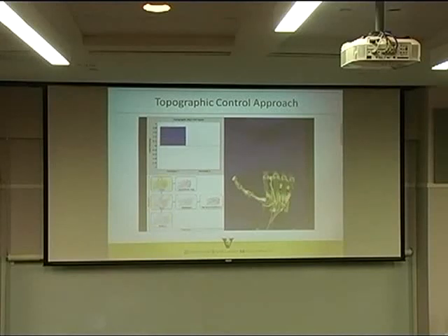You drive up the map here with that 1 signal. You take a right, which is this signal, and you're in that. That's called a lateral or key grasp. Now you go back to platform, and this next time it's going to go up to point, and then you're going to go over to a tip grasp, and then go back.